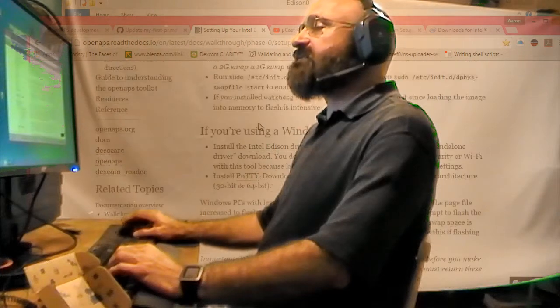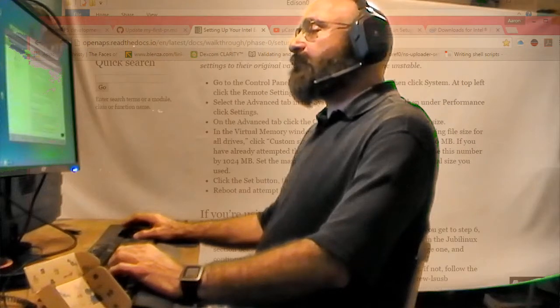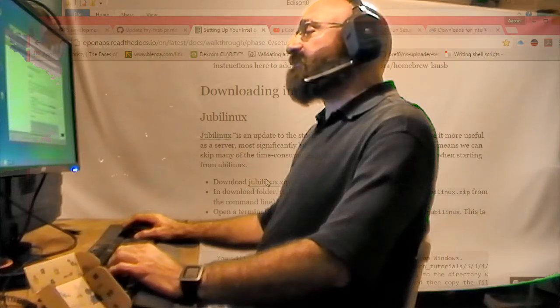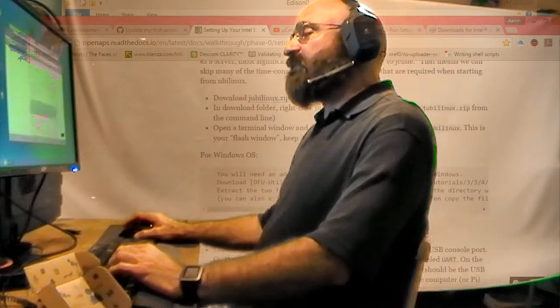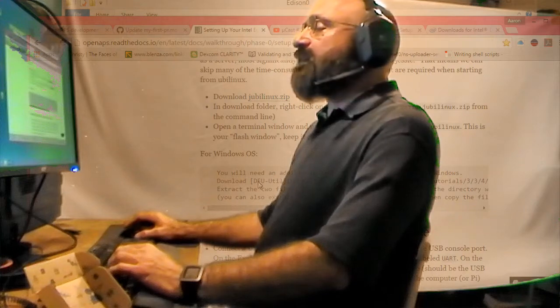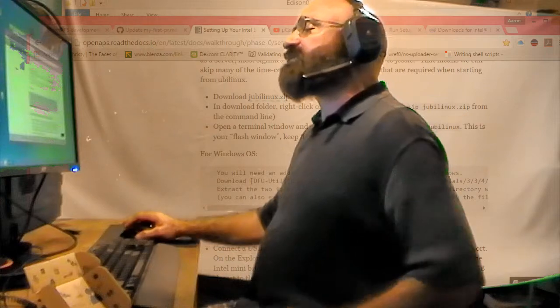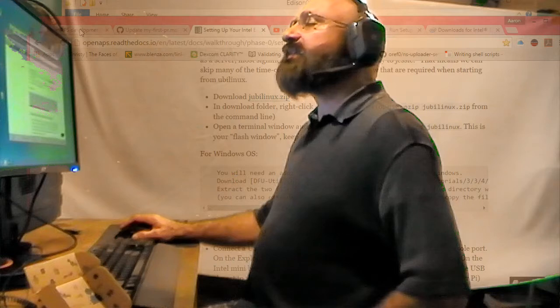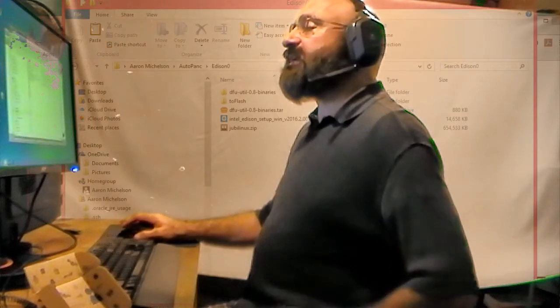And here it's going to show us we need this Edison driver for Windows, we need PuTTY, and we need ubilinux. Download the ubilinux zip. So you can click on these files. Okay, and here's a good place to get the dfu-util. I got this from here. I think I got this from here too, I'm not sure. And I don't know if my method here follows their method, but here is the way it works for me.